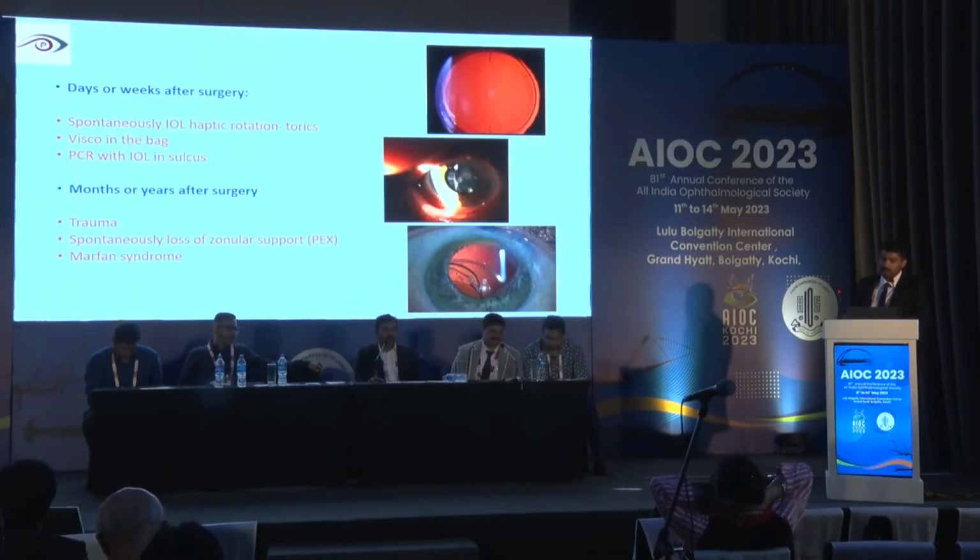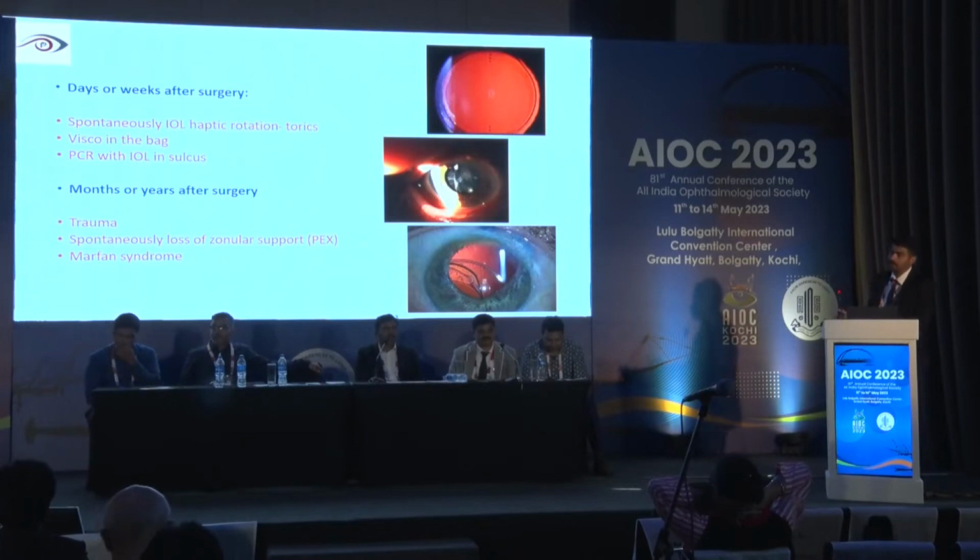So it could happen intraoperatively or 1 or 2 days or few days after the surgery, but usually we don't see the patient a few days after the surgery. Even if the patient calls you and says, I don't have very good vision, over the phone you would want to comfort the patient and say, we'll wait for a few days, it could get better. But if you would have left visco in the bag in a toric IOL, it could have caused a rotation of the toric IOL.